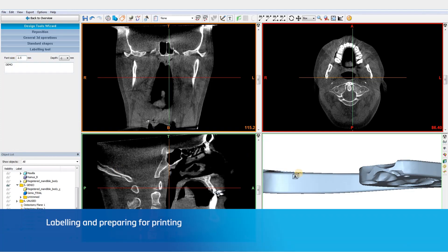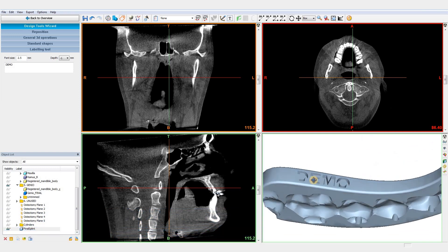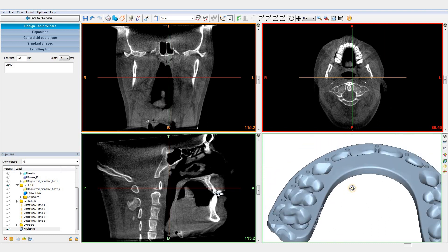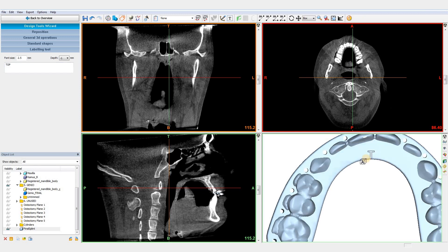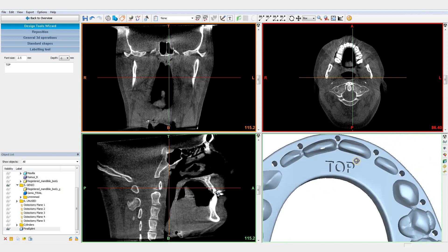Once we are happy with our final splint design, we can label the splint with the patient ID for traceability. Finally, the splint is optimized for 3D printing, after which we export the splint as an STL file and send it straight to the 3D printer.